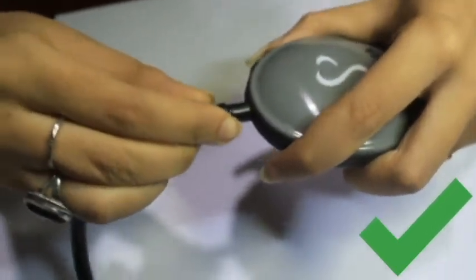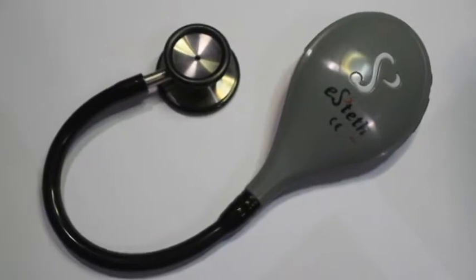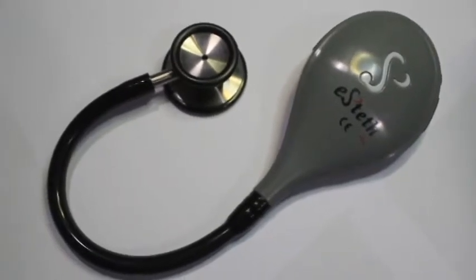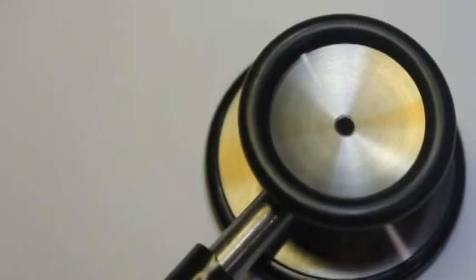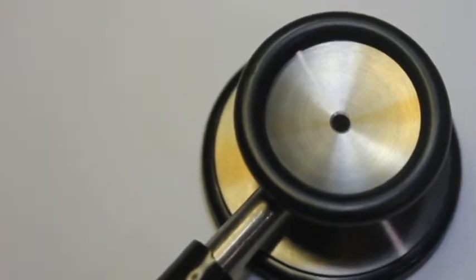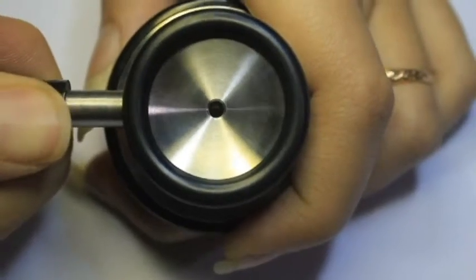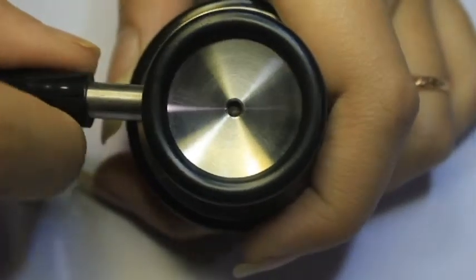Mistake number two is when you use the chest piece of the stethoscope without locking it. The correct way to get the maximum quality of sound is to hold the neck of the chest piece firmly and give it a slight twist.